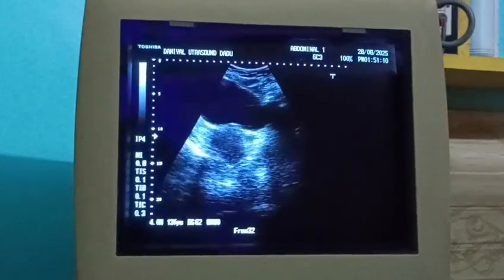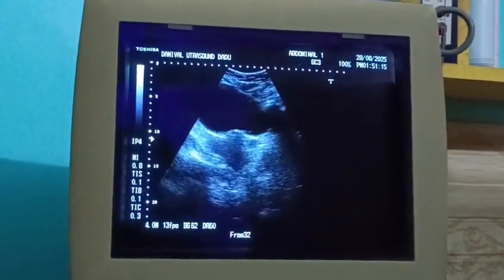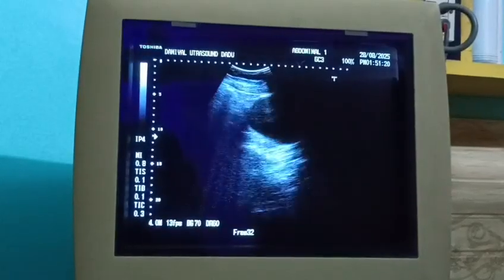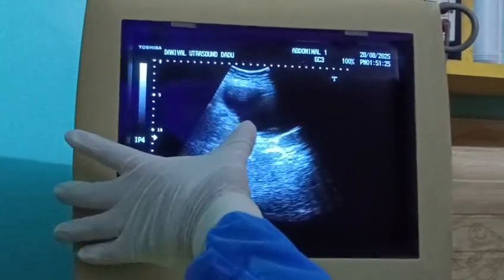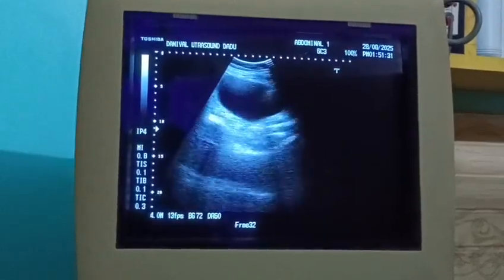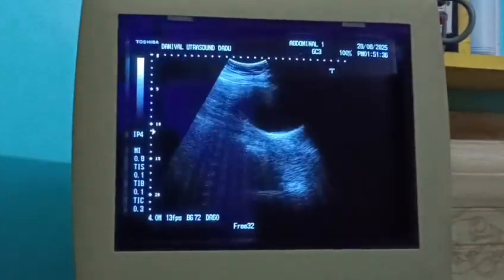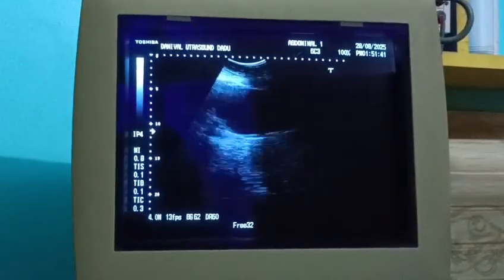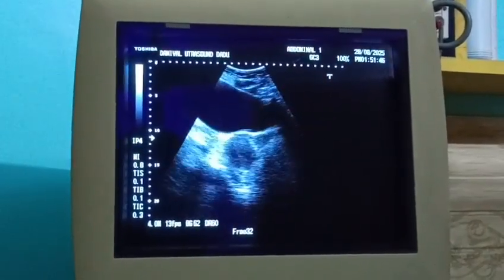And now patient has to undergo many other investigations like cervical pap smear for cytology and pelvic examination and so on. So there are ovaries which appear normal, right and left. Here is the right ovary. This is the right ovary which appears normal. Similarly, the left ovary is also normal. Our main focus, again I say, is on the position of the uterus. So this is acutely retroflexed uterus on its own axis.